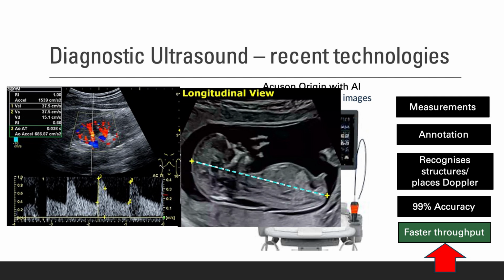So this is a liver, and that's a hepatic vein in the liver. And the ultrasound has been able to almost like climb into the hepatic vein. So you're now here in the hepatic vein, and you can go down it. So I can walk down the hepatic vein and other blood vessels as well.